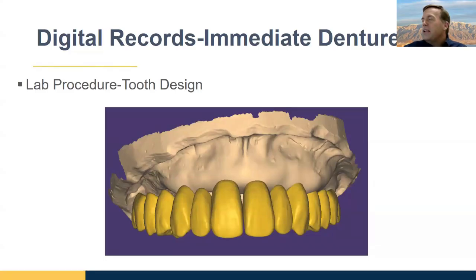Anyhow, when you're designing your teeth, thank you for the question. What I like is that you can make your teeth exactly the way you want them, so you get good proportions and all that stuff. And you can do really nice occlusal adjustments as well to set nice function. I don't remember if I showed you guys the virtual articulator or not. exocad and 3Shape have a virtual articulator that'll allow you to program the articulator with the patient's current occlusion and then reproduce that in a function called dynamic occlusion. So that's kind of a cool thing.